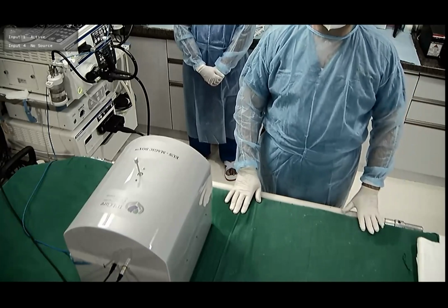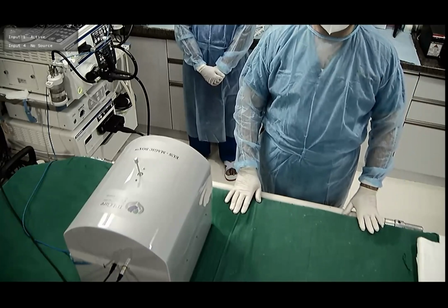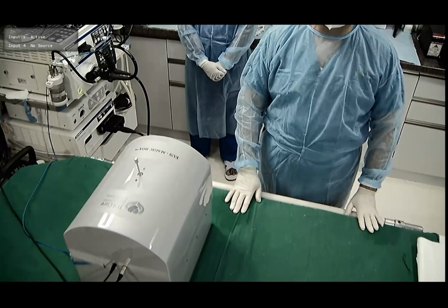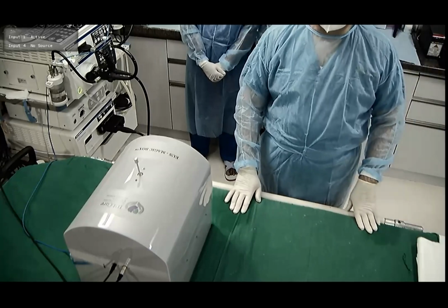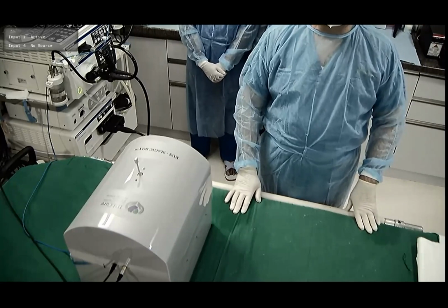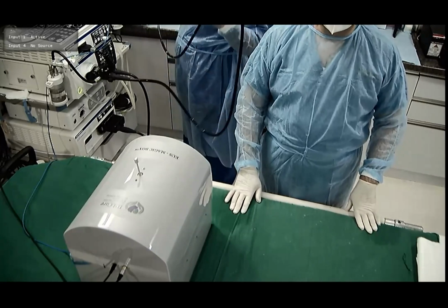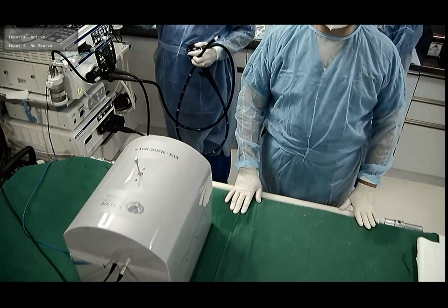It's not a very difficult model to make. You can make it yourself if you want, because you have to understand, if you like interventional EUS procedures and you need it in your department, you have to start learning. And learning hands-on is going to be difficult because there are not enough cases in most centers right now. So it is better that you prepare yourself with the basic steps by using a model.